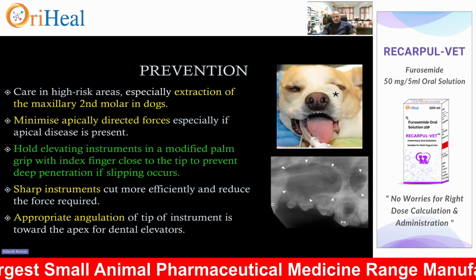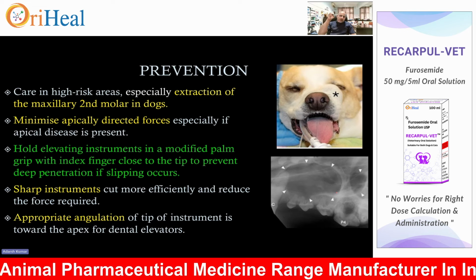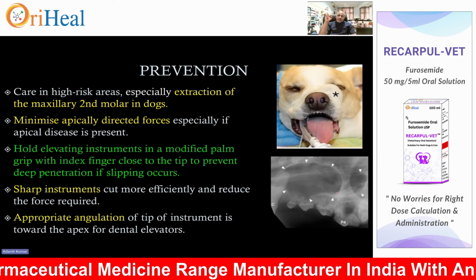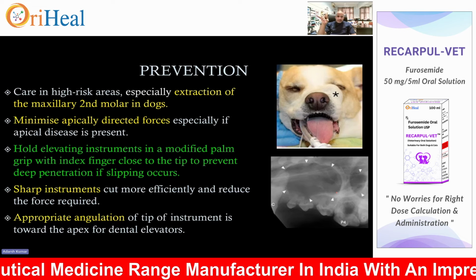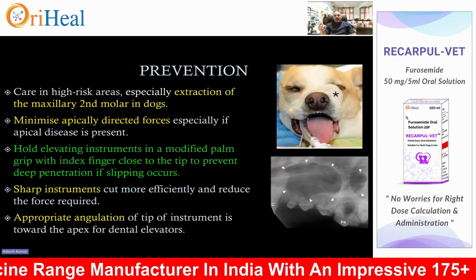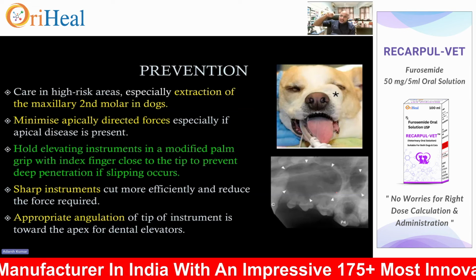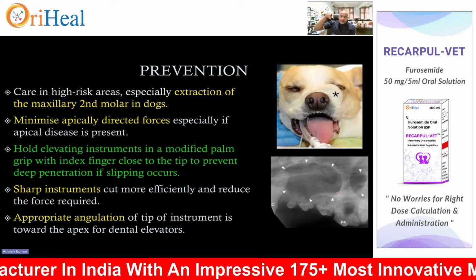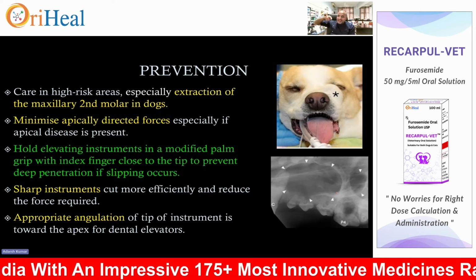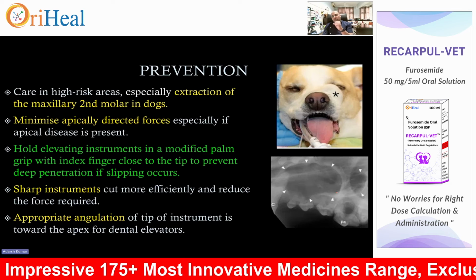Okay, then the biggest thing is your holding of the elevators here, help with the help of a palm. Then appropriate angulation and use of sharp instruments. Sharp instruments cut with a low or minimum pressure. If they are blunt, you will end up giving more pressure. When you give more pressure, that means you lose control over it, right?